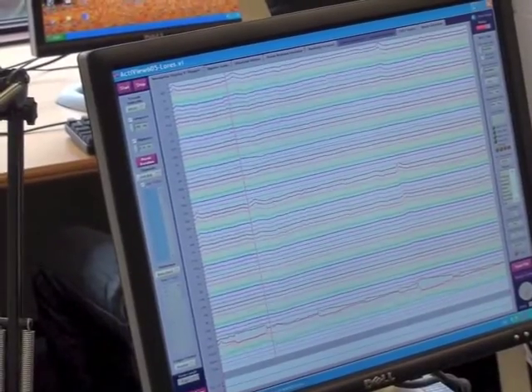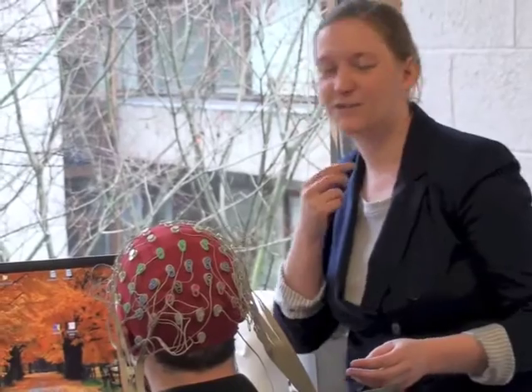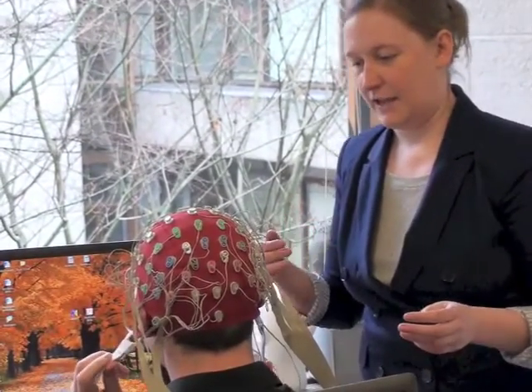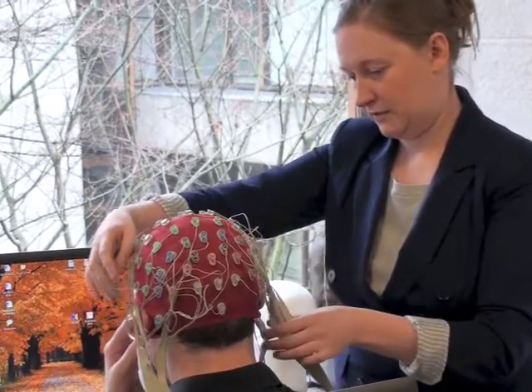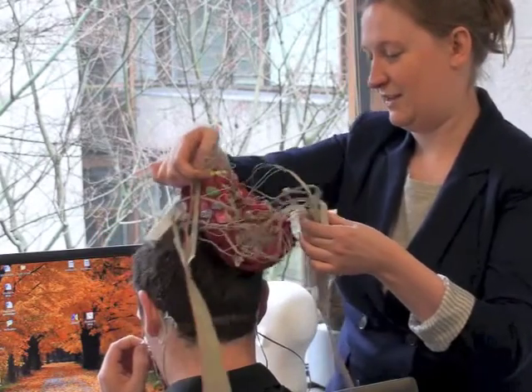Right, so what I do now is you can just loosen the cap if you want to take off the cap. Most people are delighted, it's quite tight on the neck. Yeah, because it's Velcro-y. So if you want, you can take off the ones on your face. And you can just lift the entire cap off of this, so it's very quick. There you go.